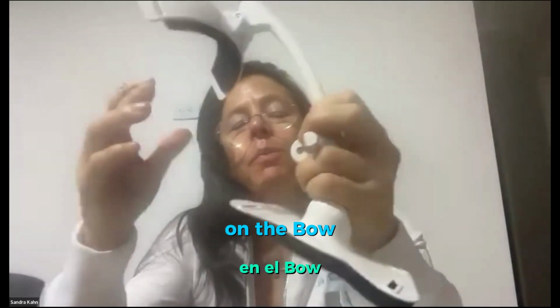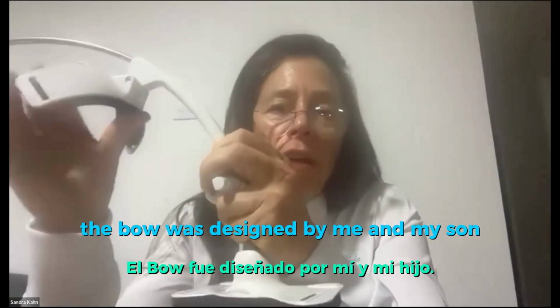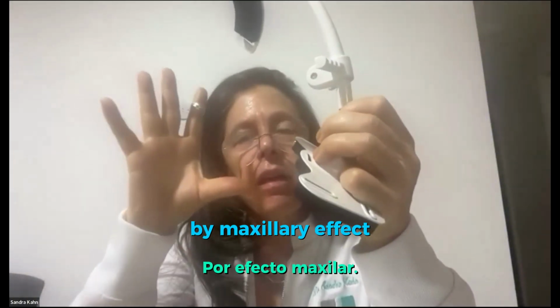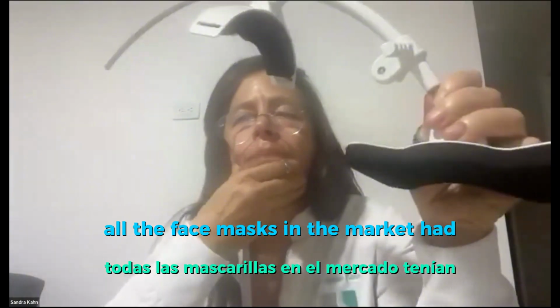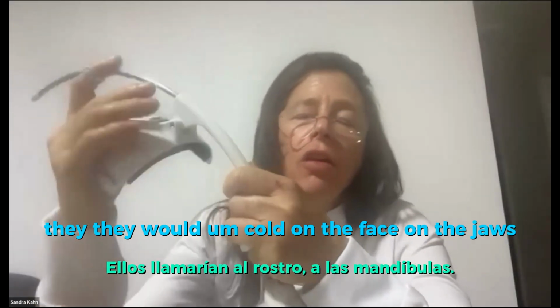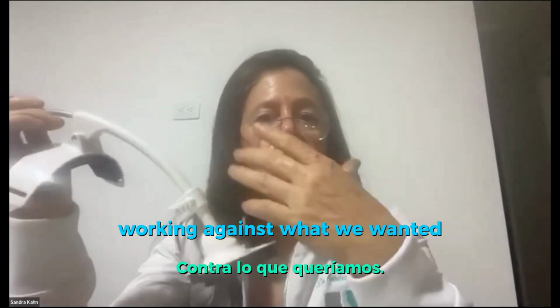The bow was designed by me and my son to address his issues, because there wasn't a mask that had a bimaxillary effect. All the face masks on the market would pull on the face, on the jaws. So there was a vector of force working against what we wanted.